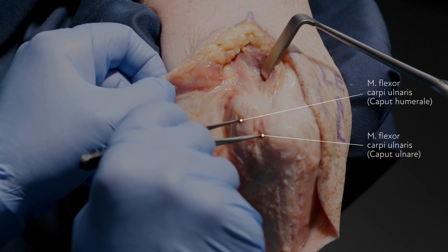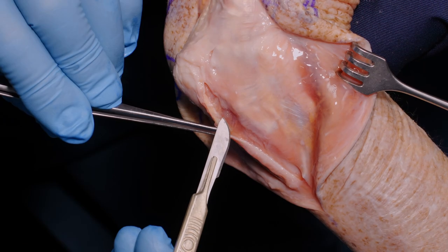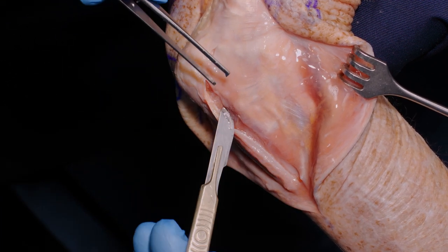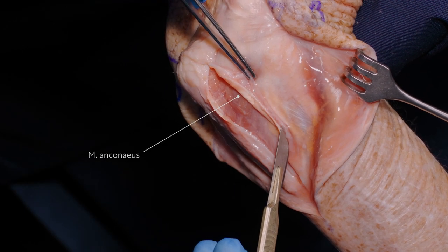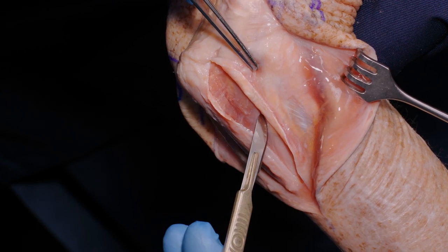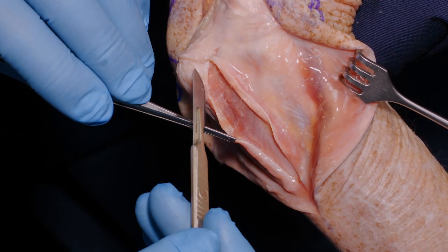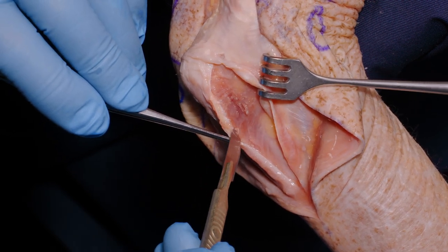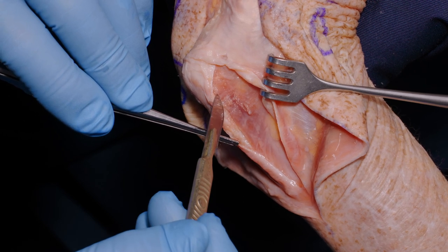We will now go ahead and dissect the nerve and then demonstrate the anconeus. Here is an incision in the antebrachial fascia overlying anconeus. Here we see the fascia just elevated off the muscle a little way. The muscle is this beautiful triangular muscle which takes attachment from the humerus and ulna, and also attaches all the way down the ulna border of the proximal ulna.